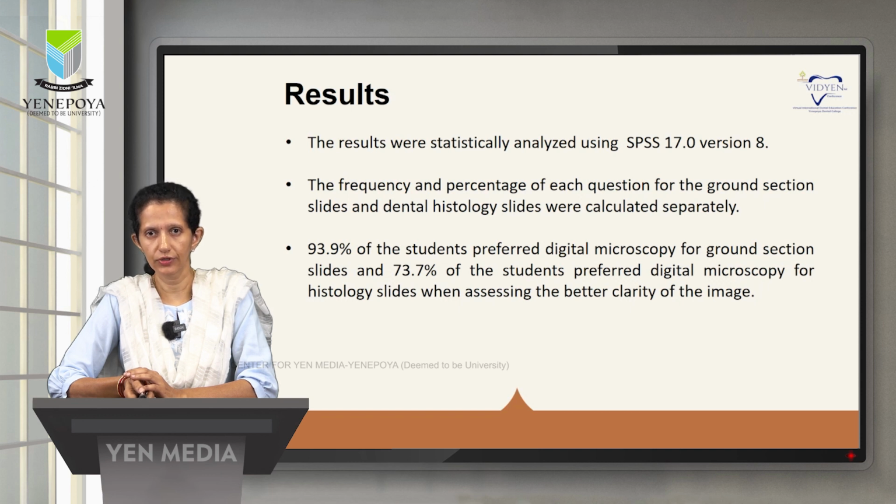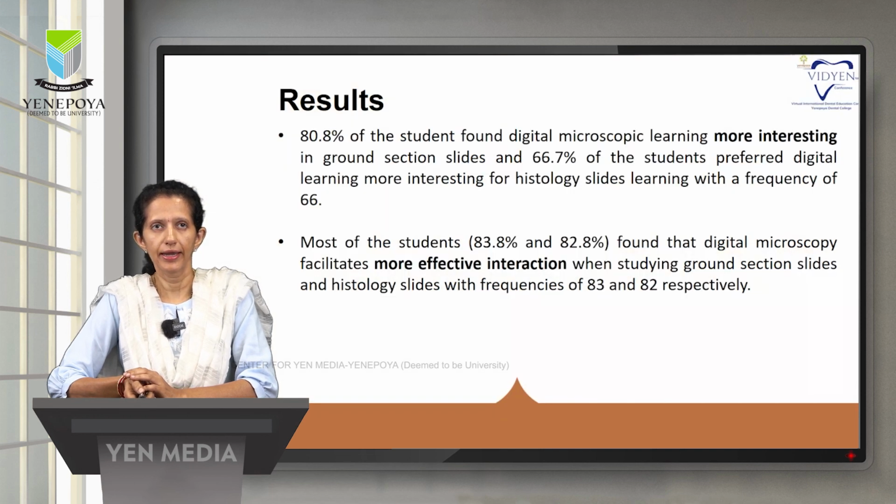93.9% of the students preferred digital microscopy for ground section slides, and 73.7% of the students preferred digital microscopy for histology slides when assessing the better clarity of the image. 80.8% of the students found digital microscopic learning more interesting in ground section slides, and 66.7% of the students found digital learning more interesting for histology slides, with a frequency of 66.